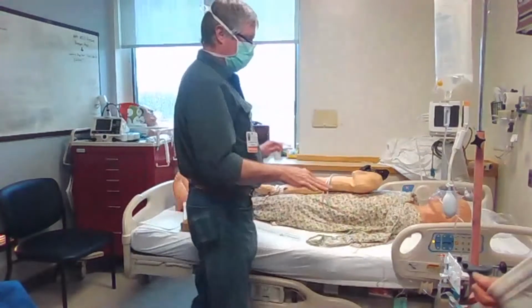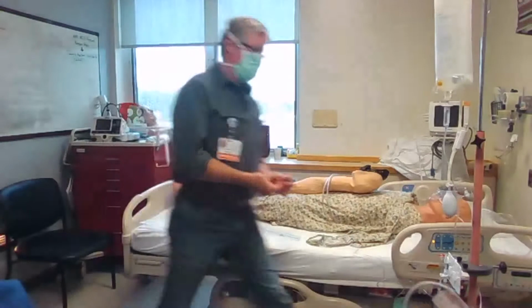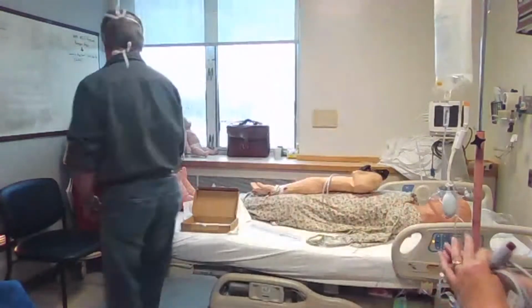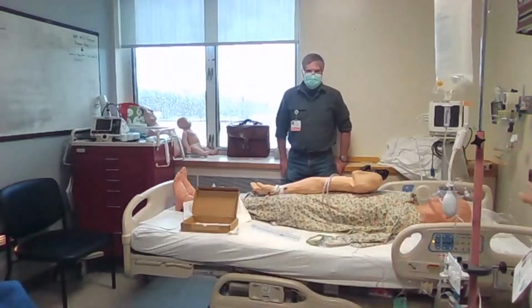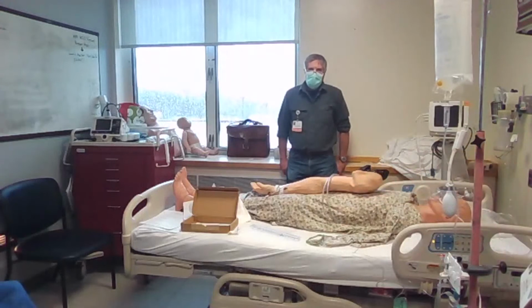So that's zeroing. Questions on that? I think that's the most confusing. So I'm still a slight bit confused. Say you're positioning your patient, maybe they're anesthetized or comatose because they're a trauma patient and you're coding them. If you've got the A-line set up and then you move the bed because respiratory came and wanted to intubate and needs it higher, you're moving the patient, but this is staying the same.